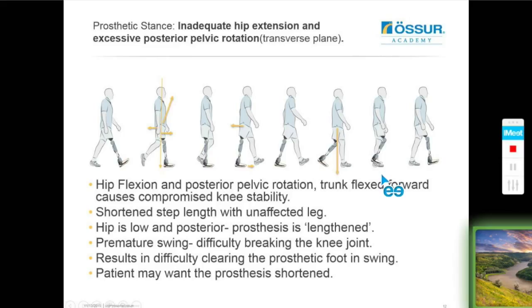And in all likelihood, your patient is going to say to you, my prosthesis is too long, can you make it shorter? Because they're finding the knee hard to break and they're dragging the foot along the ground.